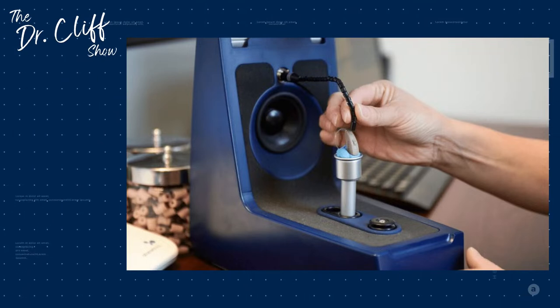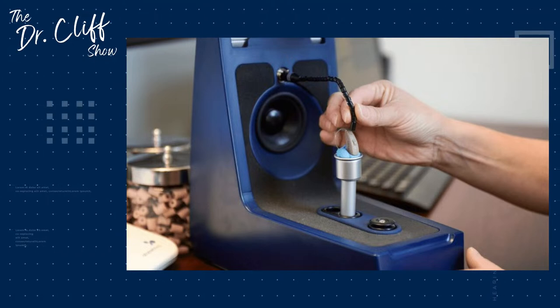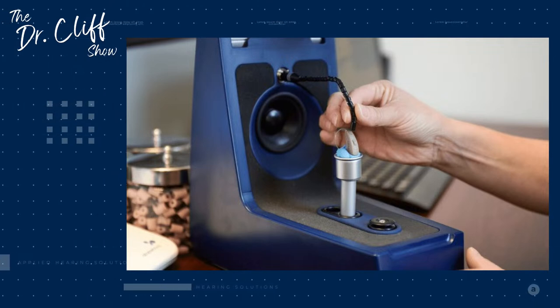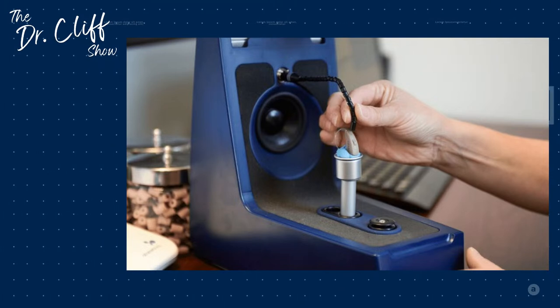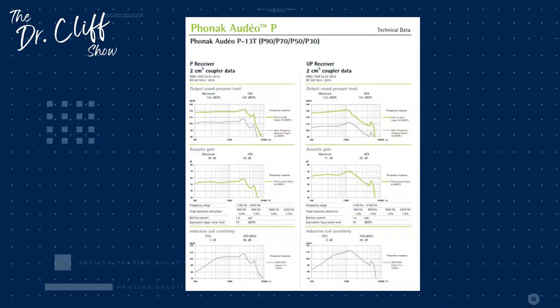And then we have a reference microphone, which is being held by the fingers there on the screen, right over the front microphone. So we can actually know what the sound is going into the hearing aid, and then we basically measure the output of the hearing aid to measure a variety of different things. And let's go ahead and pull up the data sheet here for what we get from a hearing aid manufacturer.